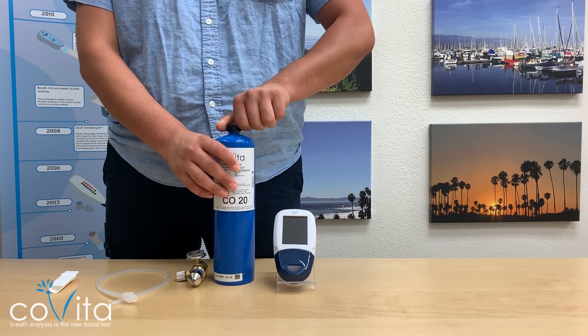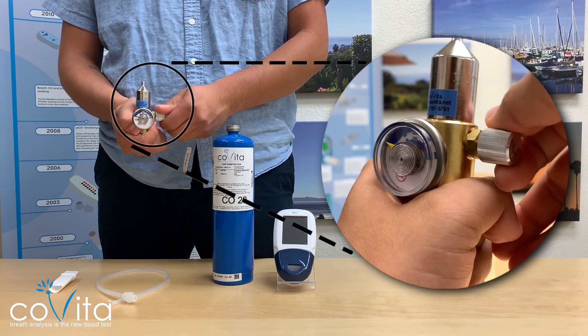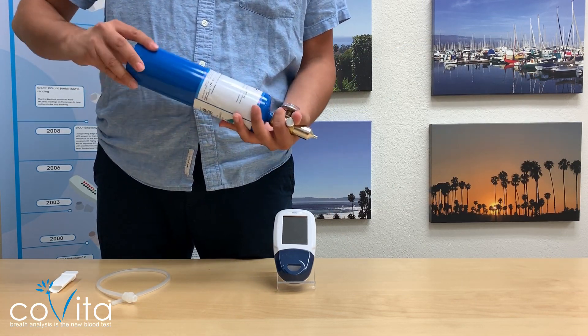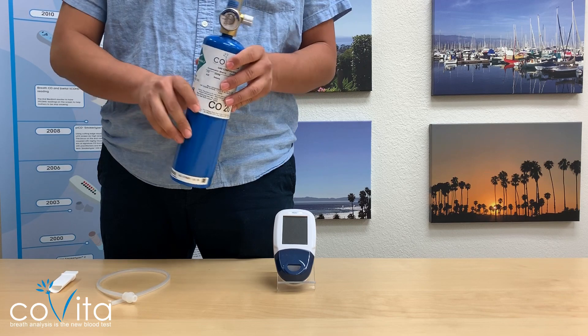Remove the black dust cap from the can of gas. Ensure the control valve on the flow meter regulator is in the off position by twisting the valve clockwise. Screw the regulator flow meter onto the gas can — some slight pressure may be required. This can be done by screwing the gas can into the regulator.